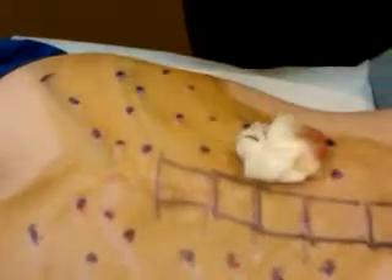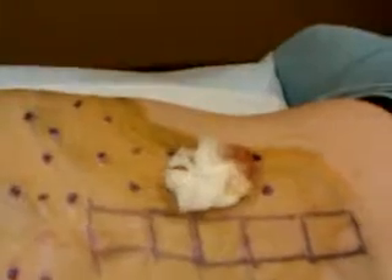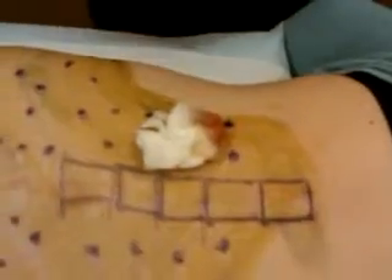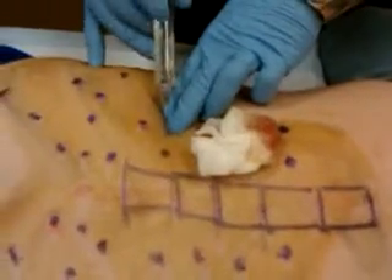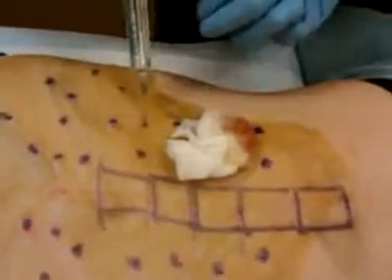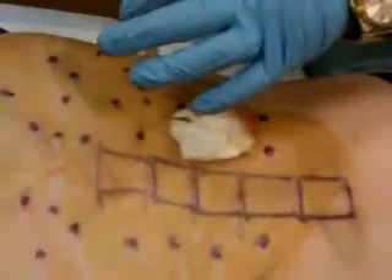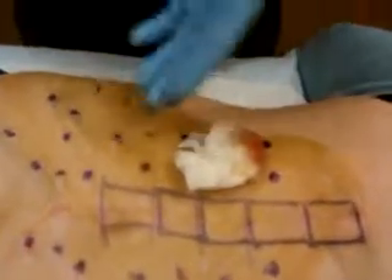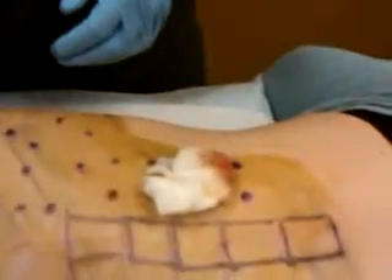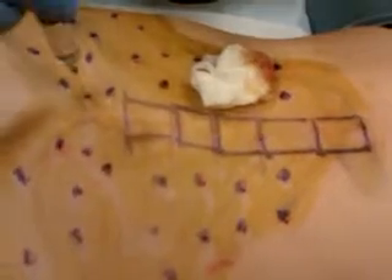She's a very good patient. You can see how steady she is — she doesn't move much. The lack of trying to punch you. I'm sure she wants to punch me, but she's not doing it because she likes me — because I'm good-looking. She doesn't do it because this is actually hurting her and this provides her decent relief. You can see the scar from the horrendous surgery — it didn't do her justice. It's just failed back syndrome, so nothing else can be done to relieve her pain.